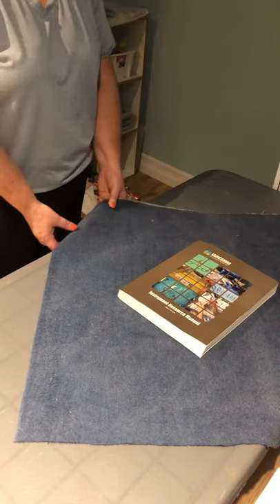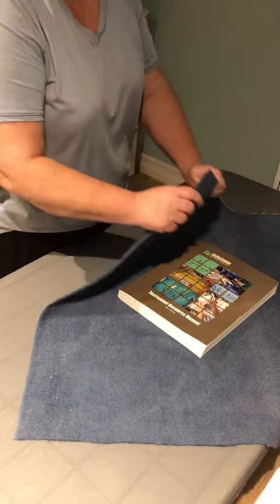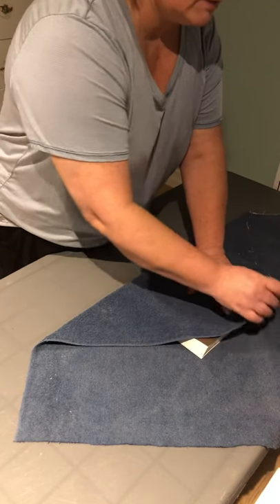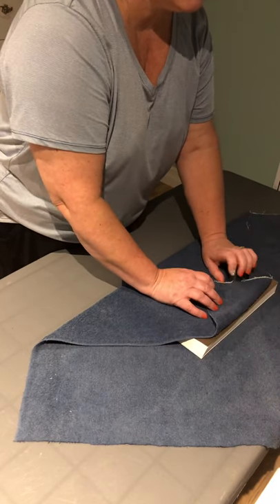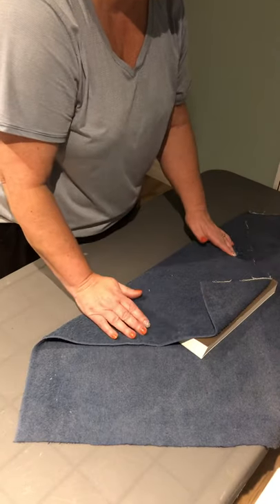I will fold, or bring, the lower corner of the wrap up over the package and fold back the wrap to form a tab.